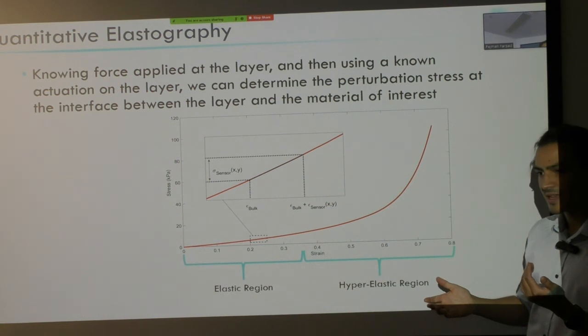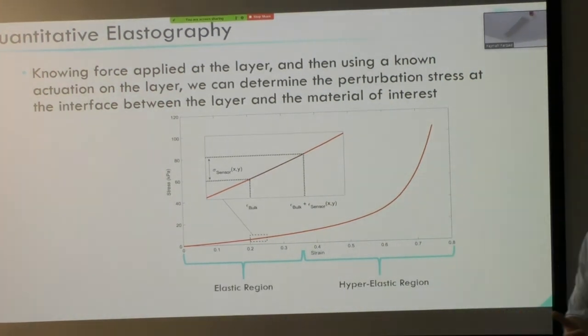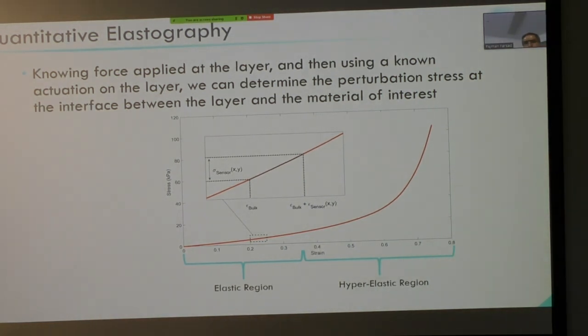So it's very dependent on how you actually take the images. For my situation, the layer thickness was about 500 micron, and the total imaging region in OCT is about 2.5 mm. So you can minimize that effect by having a larger phantom or a larger stress layer or lower preloads. It becomes quite a nuanced question depending on how you actually take that image.